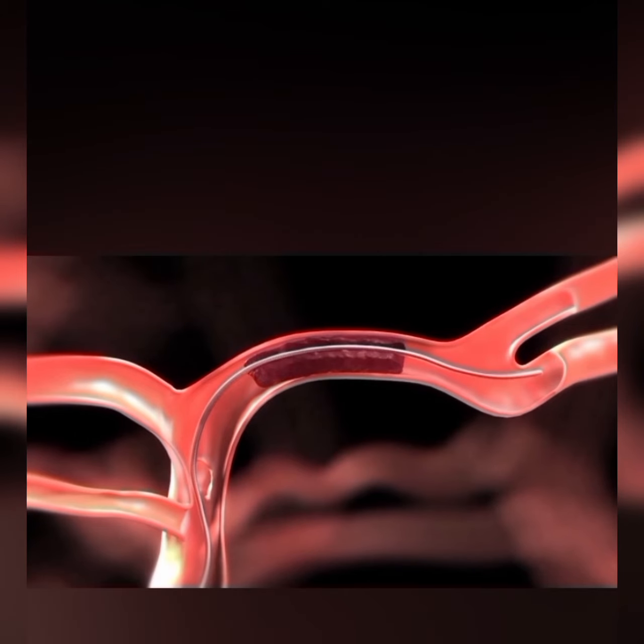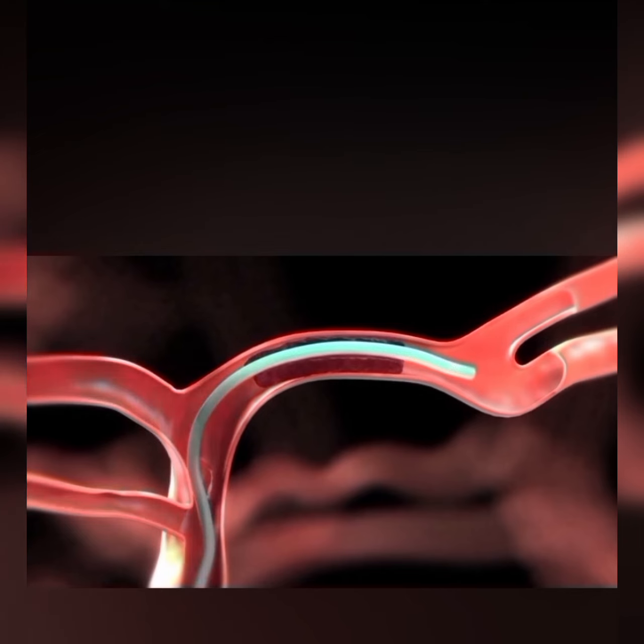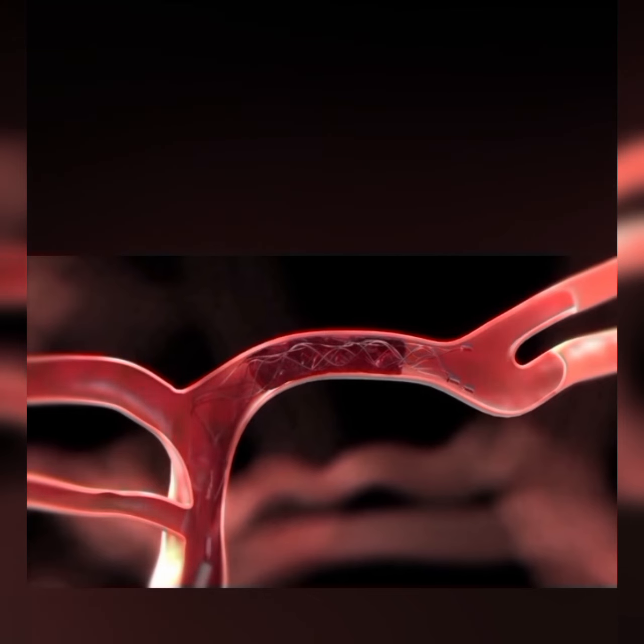So we bring up our microcatheter all the way up into the middle cerebral artery in the brain and cross the blockage. Once we're across the blockage, we bring up a mechanical thrombectomy device, which is kind of a stent on a stick kind of configuration. It's a stent-like device that we unsheath within the clot in the blockage. You can see the stent is opening up and actually restoring blood flow immediately.